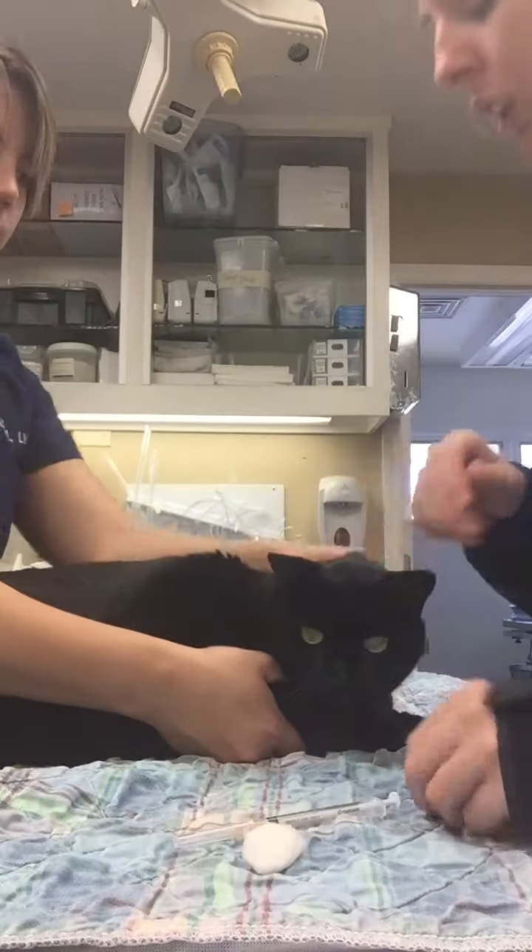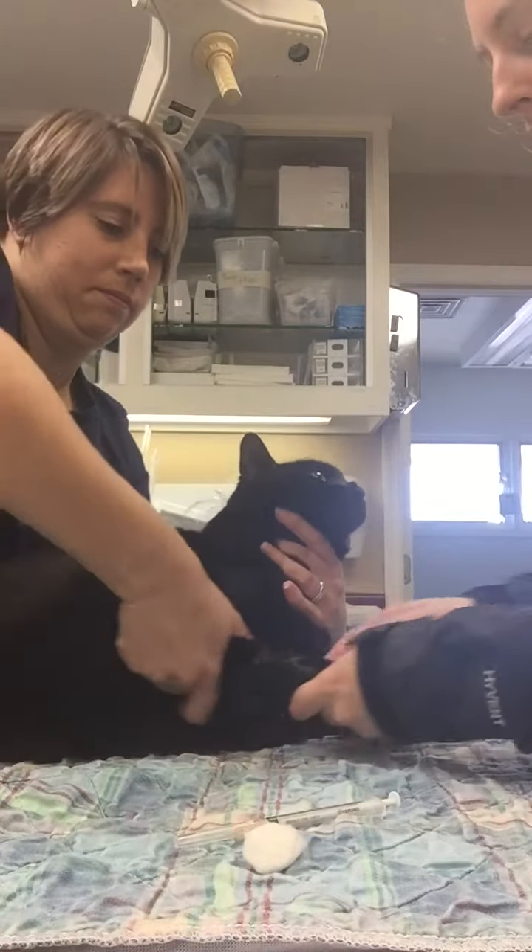I'm going to get my restrainer to restrain for me, holding off the vein.